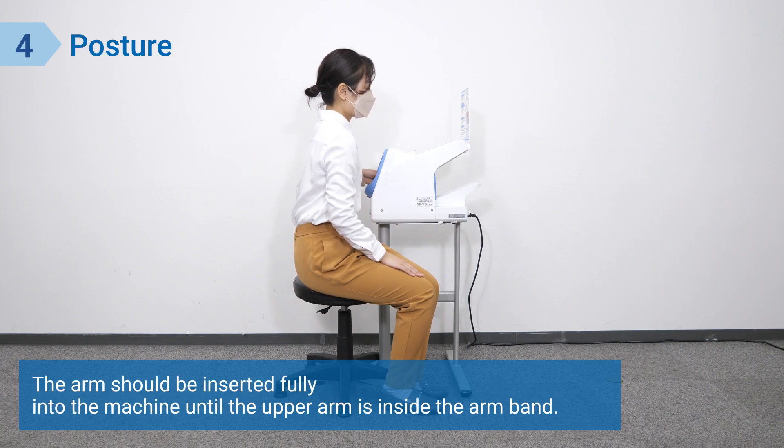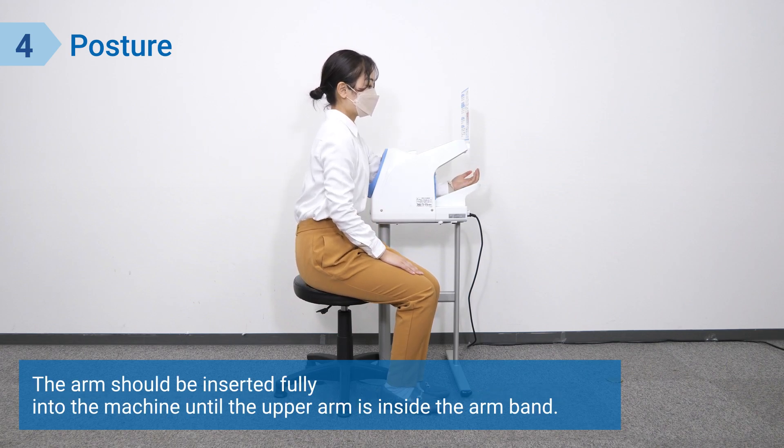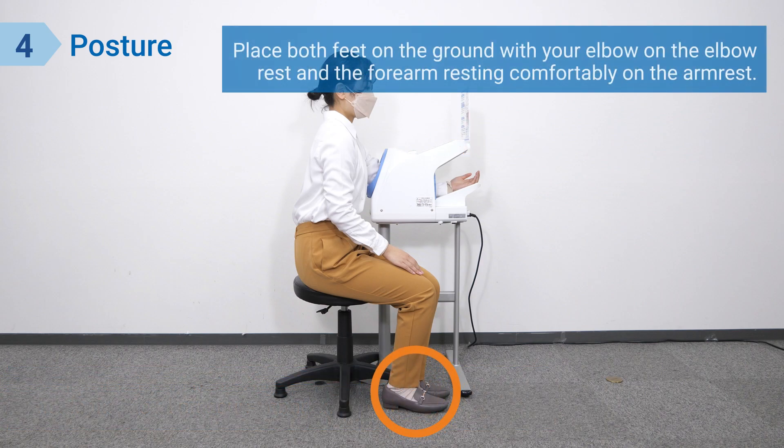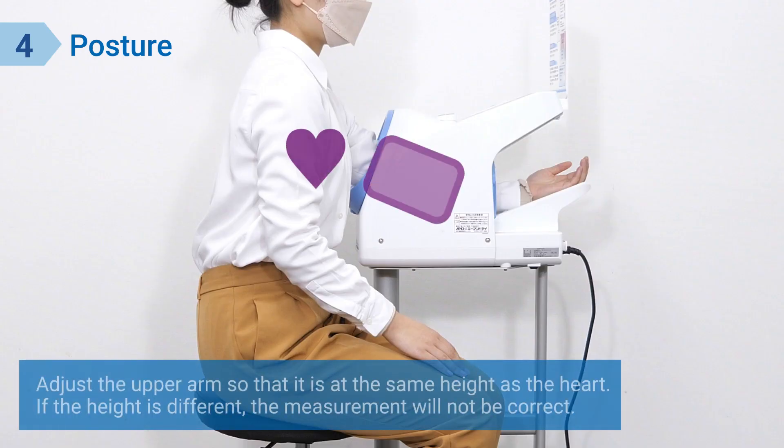The arm should be inserted fully into the machine until the upper arm is inside the arm band. Your palm should be facing up as you place your arm inside the blood pressure monitor. Place both feet on the ground, with your elbow on the elbow rest and the forearm resting comfortably on the arm rest. Adjust the upper arm so that it is at the same height as the heart — if the height is different, the measurement will not be correct.